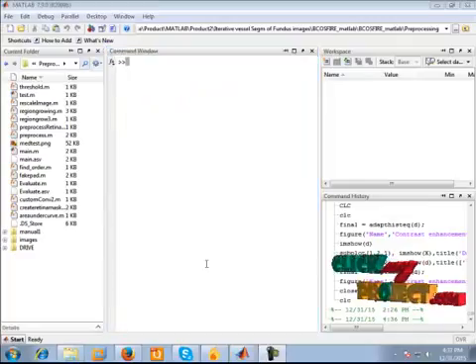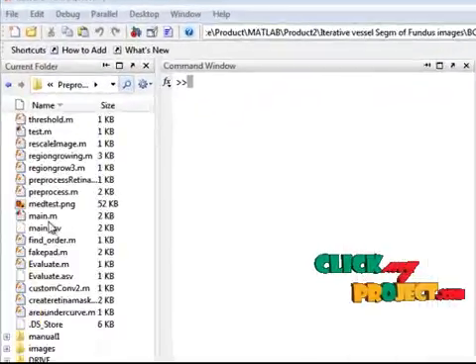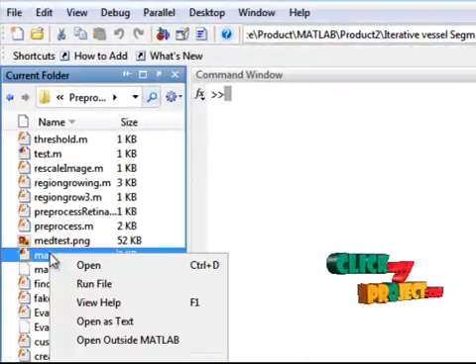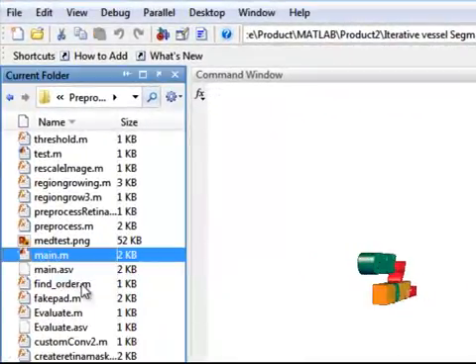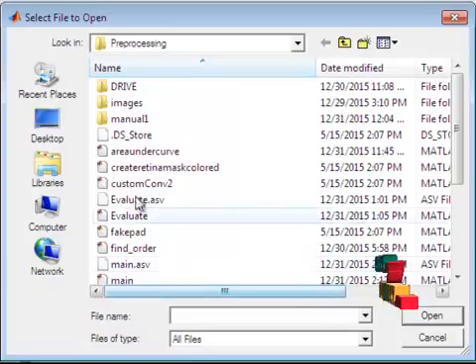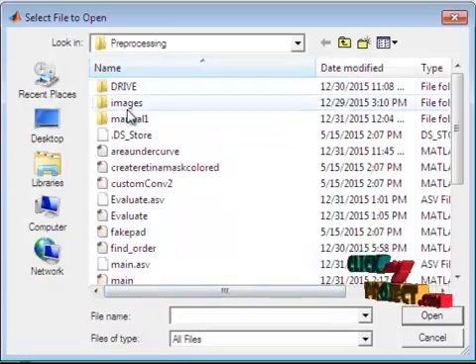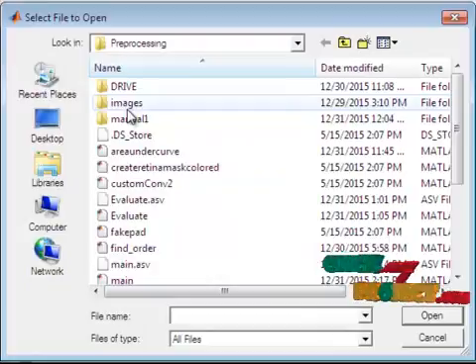Let us see the output of our project. Now we run our project. The input image is loaded.